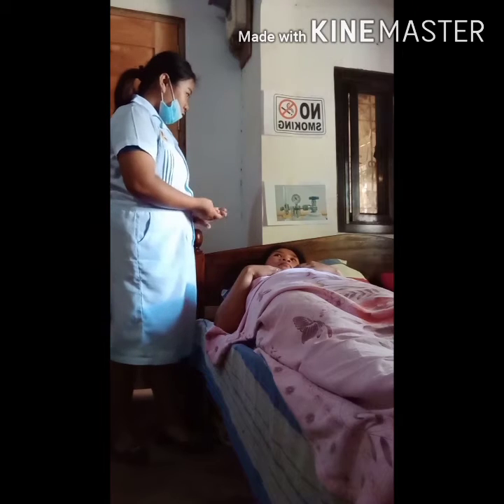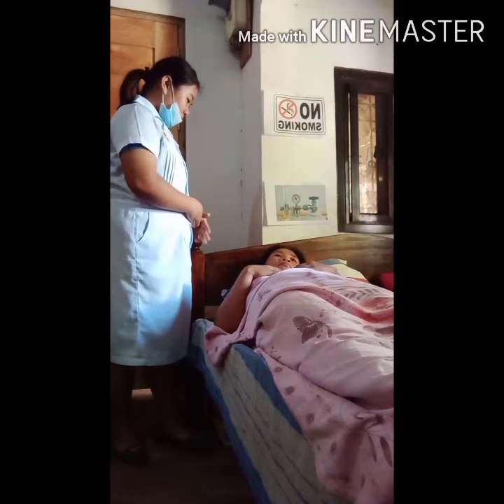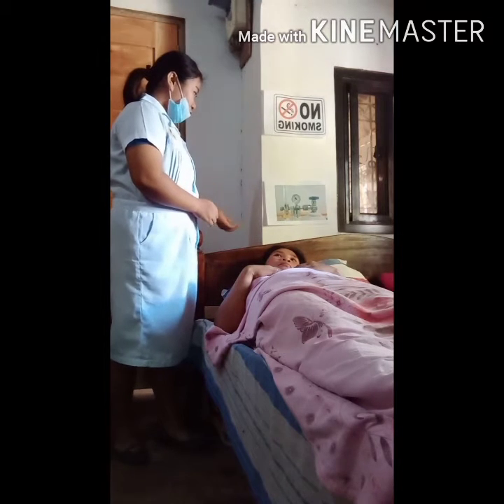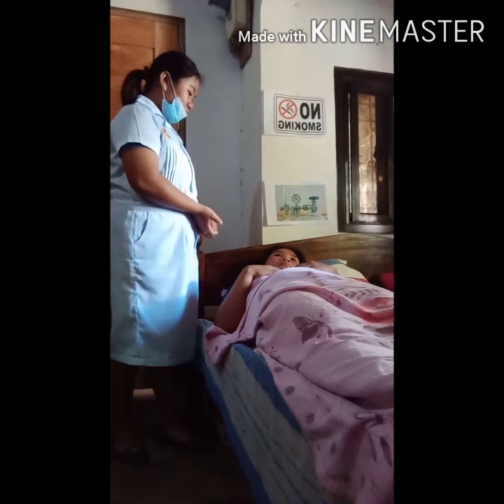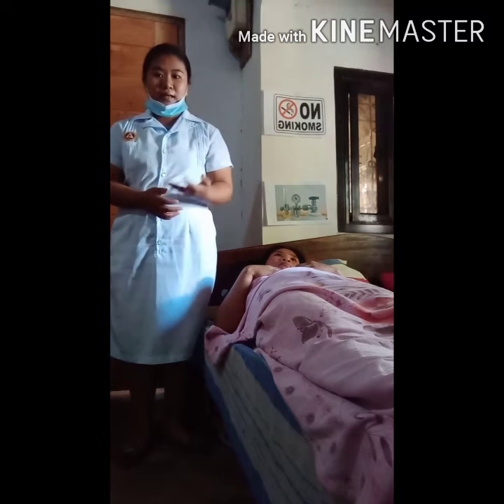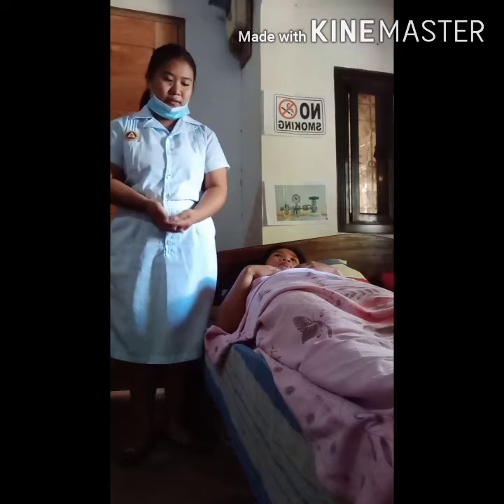So, ang gagawin ko po is ilalagay ko po yung oxygen po sa inyo via nasal cannula. And then next is assist the client to semi or high Fowler position if tolerated.